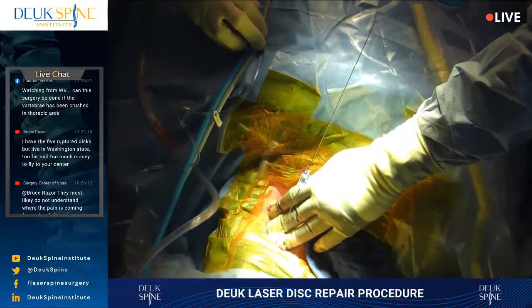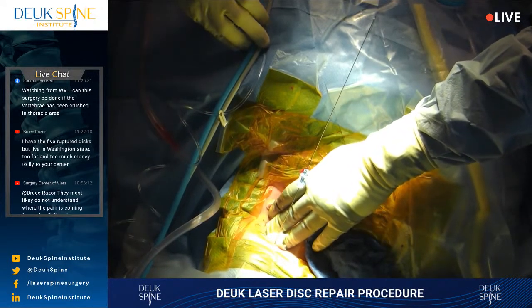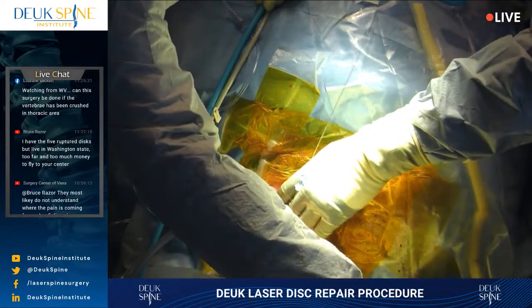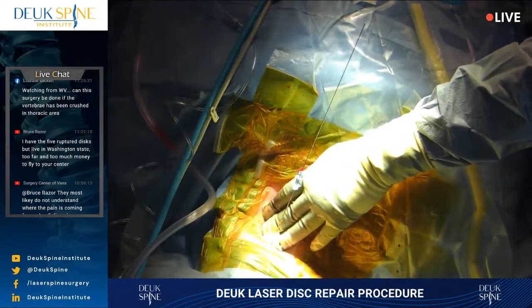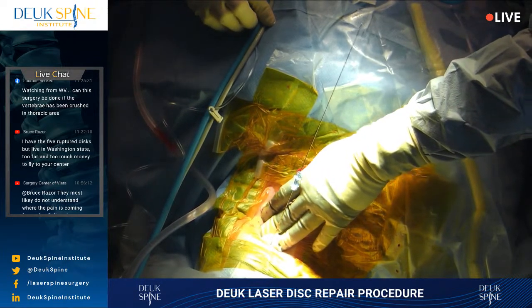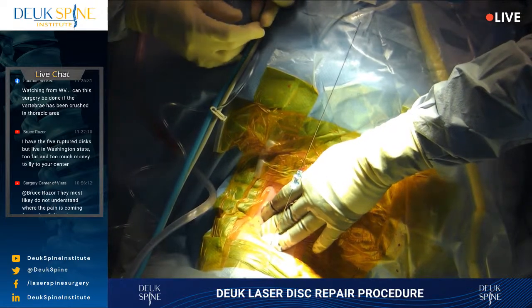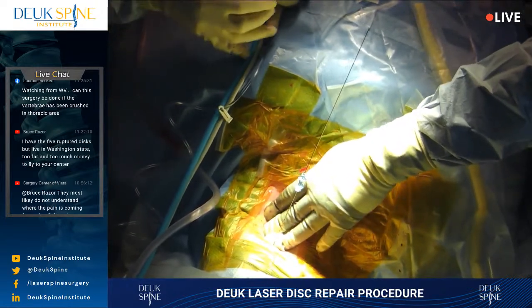All right, we are done with 2 discs, the C5-6, C6-7. You can actually see the 5-6 disc is a little wider now. We haven't added any nuclear material to it, but we've unstuck it so the end plates aren't stuck together as much. I'm holding a little bit of pressure.